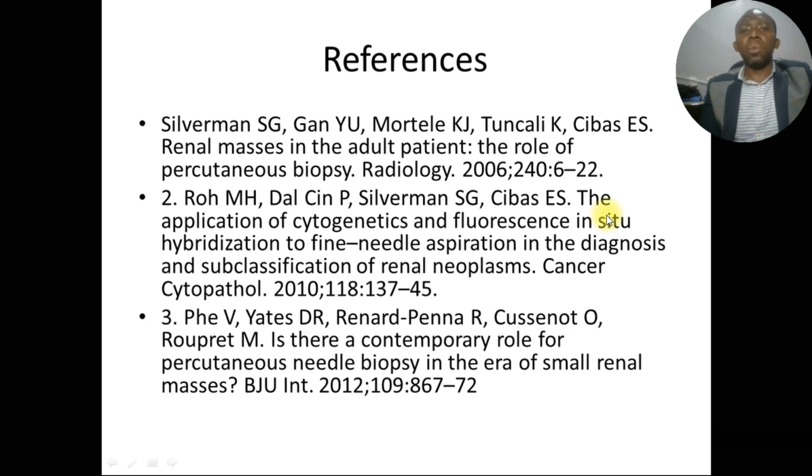So that was a brief discussion about the adrenal FNA.